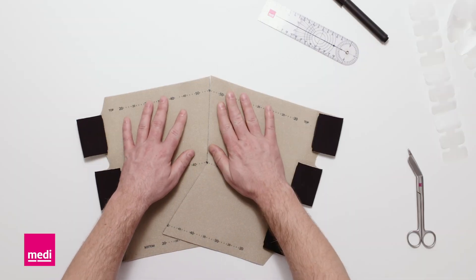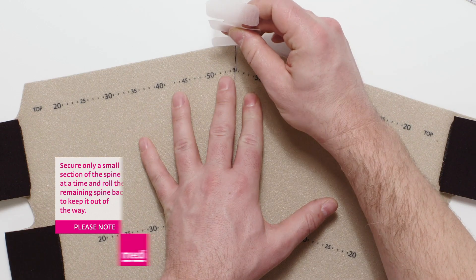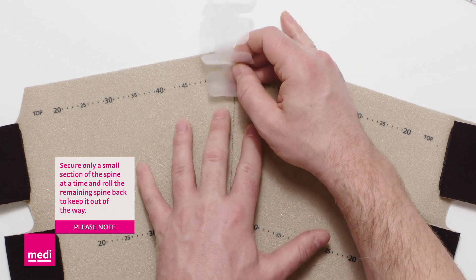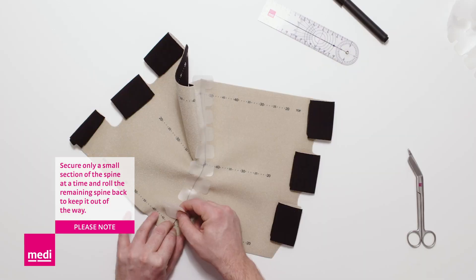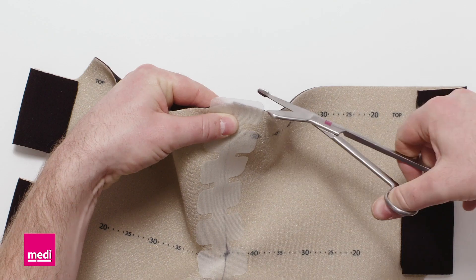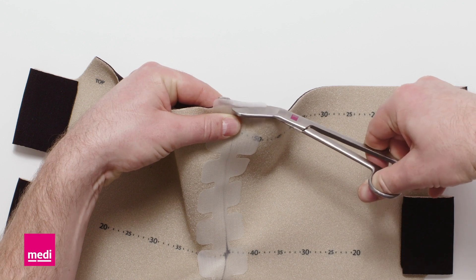Align both components precisely without overlapping. Place the spine in the middle and connect the two components. Trim off excess material of the spine.